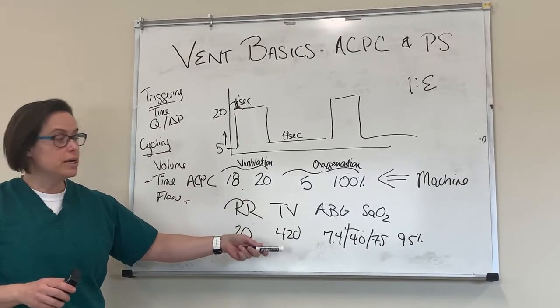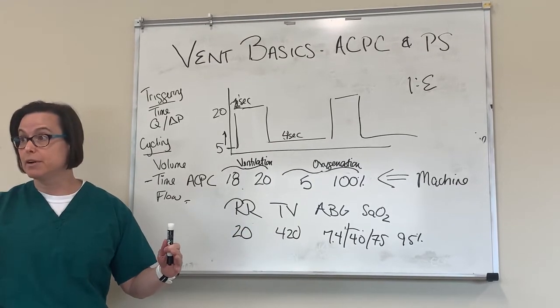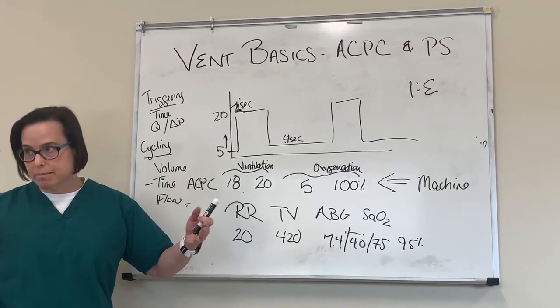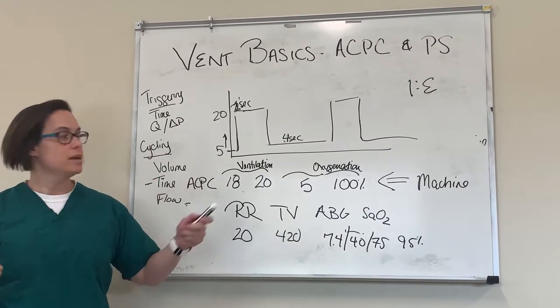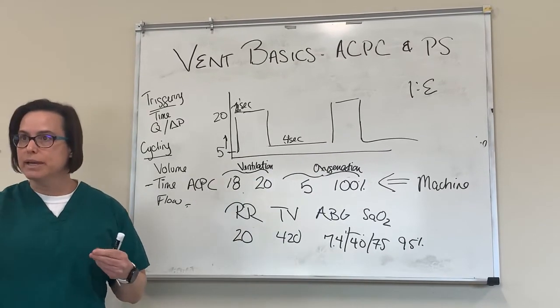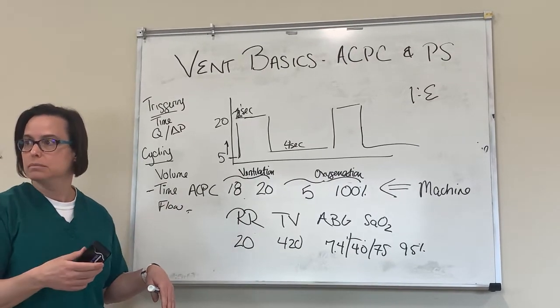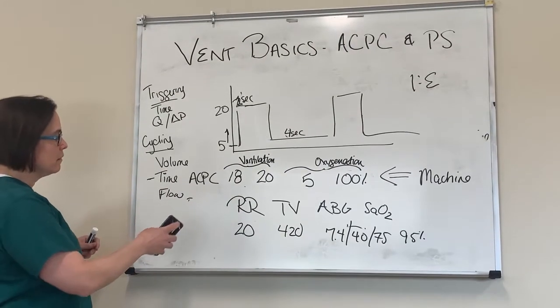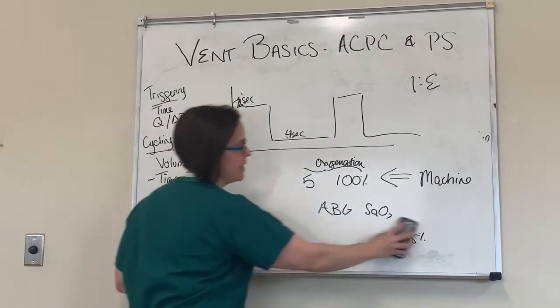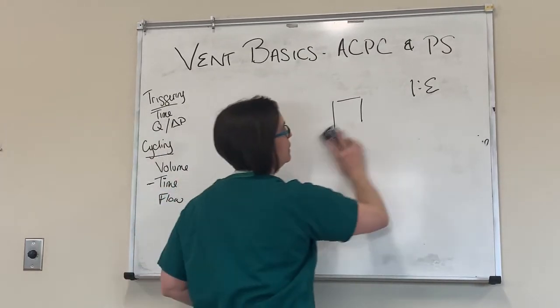I do want to point out, you can't just walk in the room and look at the tidal volume. You have to stand there for a minute or so and see how those breaths average out. They're going to be about the same, but not exactly the same. Okay, so all these other things, you can pretty much get an idea of how they are, but go in and really watch that tidal volume and see the range it's picking up. Okay? All right, so that is why I wanted you to learn about ACPC today, in case you find yourself managing 4 patients on one ventilator.